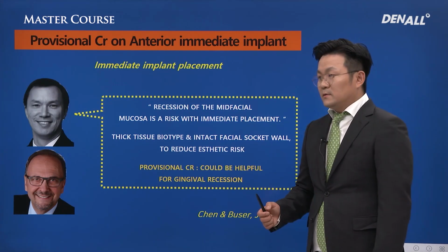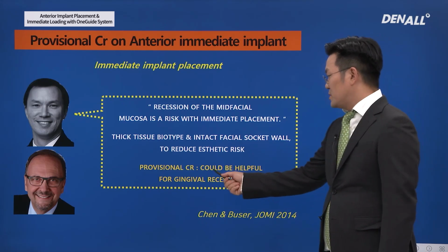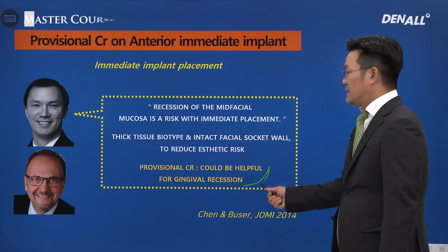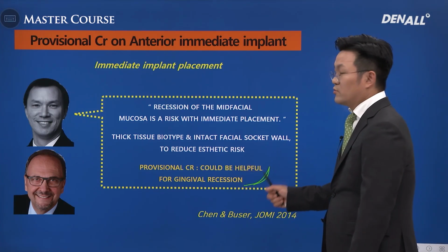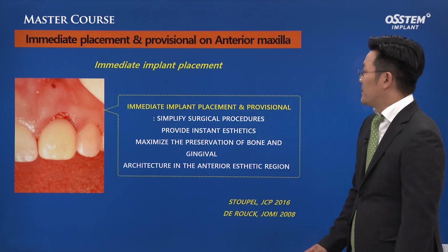Then, on the anterior side, is doing provisionals helpful? When you do a provisional crown, you can reduce recession and other problems. Hence, if possible, with immediate implant placement, it's helpful to do provisionals. That's what all the literature says.